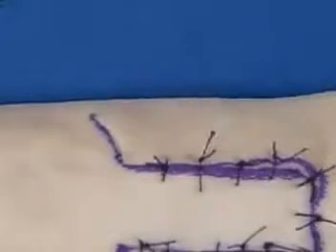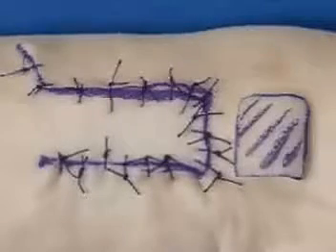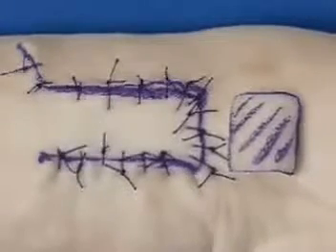The skin is then trimmed and the flap is inset. This flap is then sutured into place and the dog ear deformity is resolved.